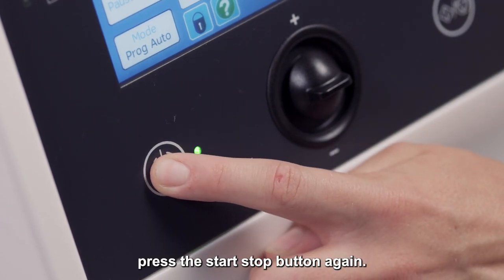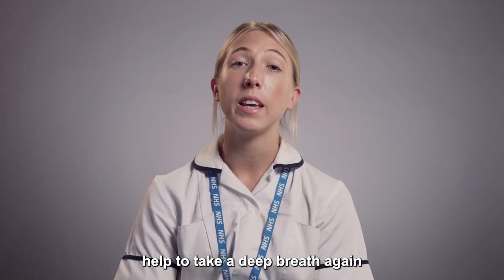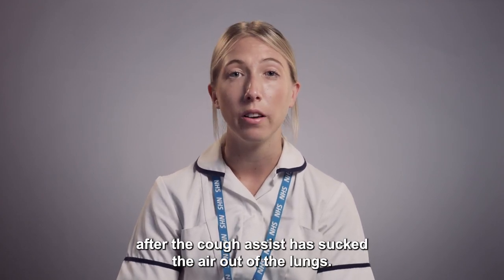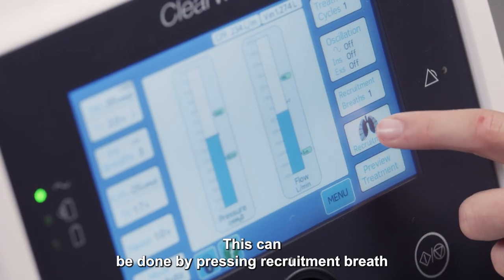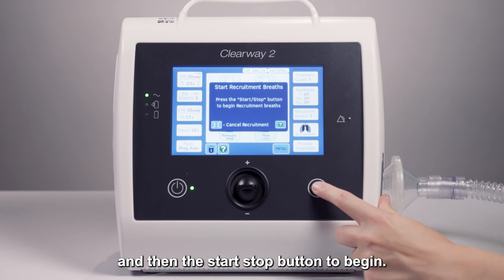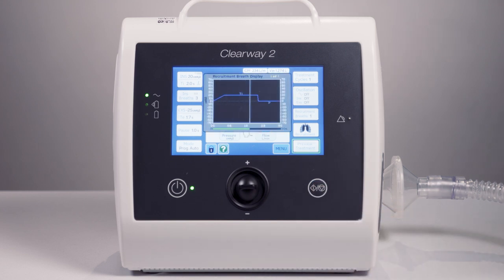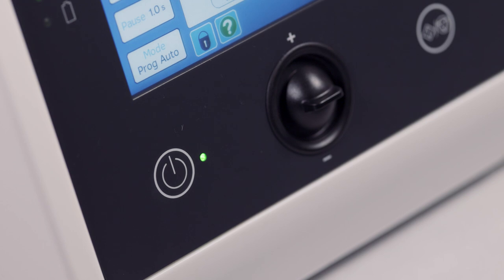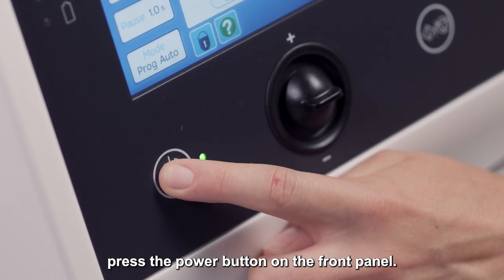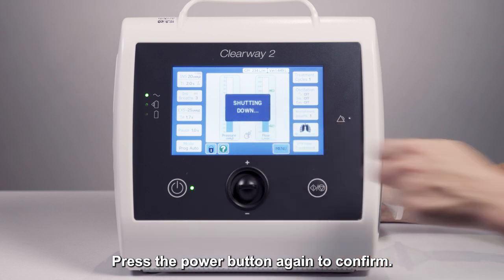To stop treatment, press the Start Stop button again. Recruitment breaths help to take a deep breath again after the Cough Assist has sucked the air out of the lungs. This can be done by pressing Recruitment Breath and then the Start Stop button to begin. To turn the device off, press the Power button on the front panel. Press the Power button again to confirm.